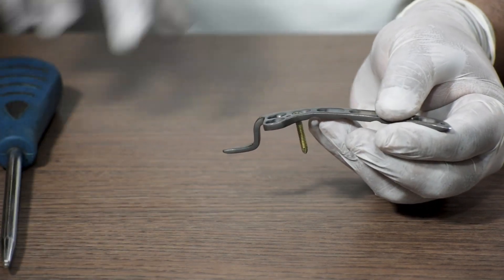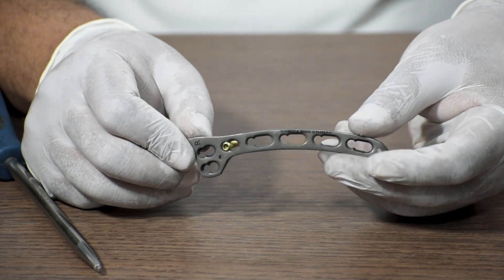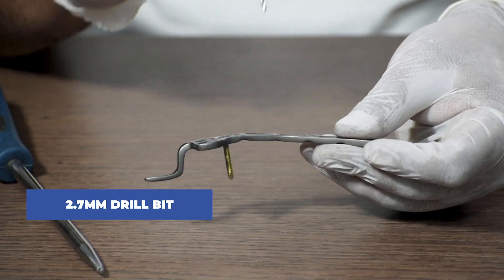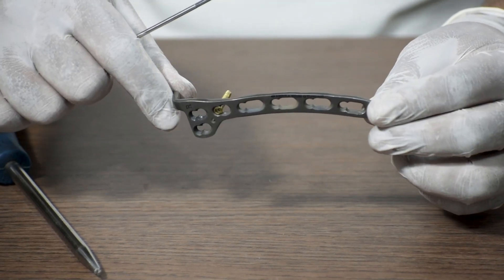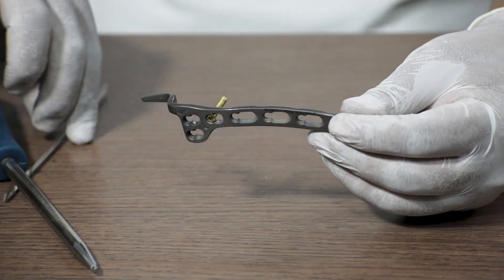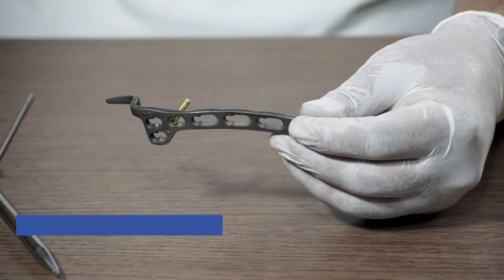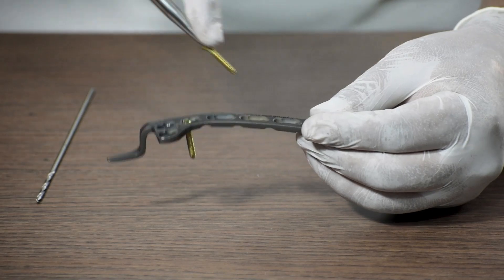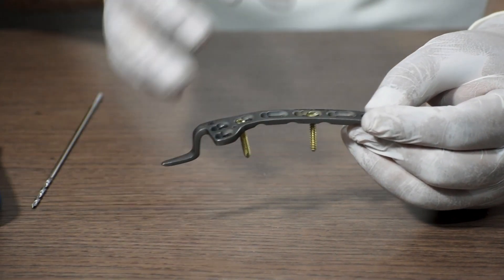If the surgeon wants a non-locking screw fixed as well, we use a 2.7 mm drill bit to drill a hole through the non-locking hole of the plate. These are oblong holes, so the screw can be fixed anywhere along them. After drilling, we use a 3.5 mm bone tap to tap and clear the way. We then measure the length required with a depth gauge, take a 3.5 mm cortical or non-locking screw of the same length, and fix it with a 3.5 mm solid screwdriver.